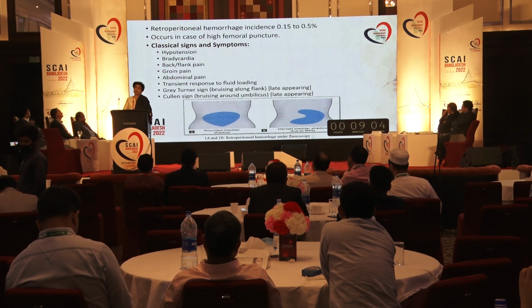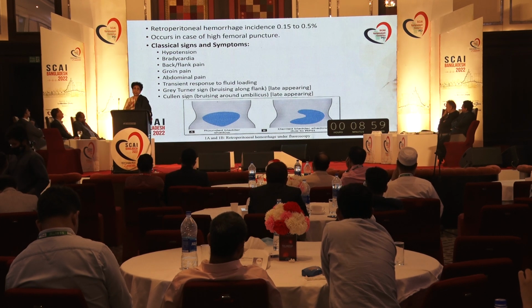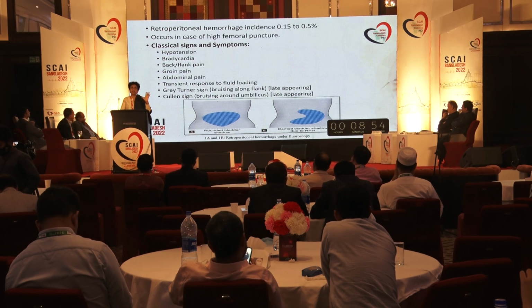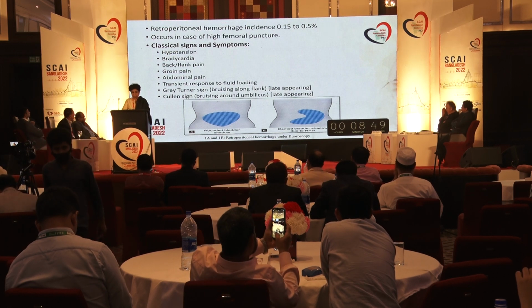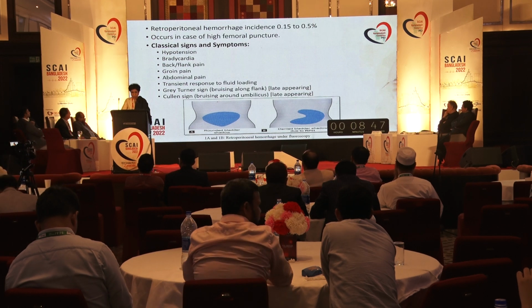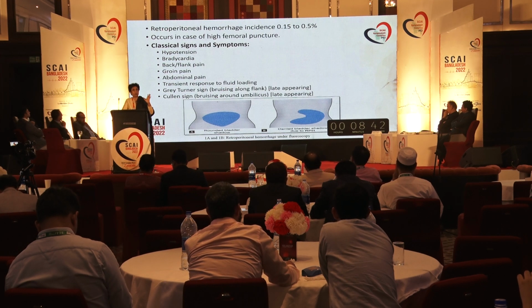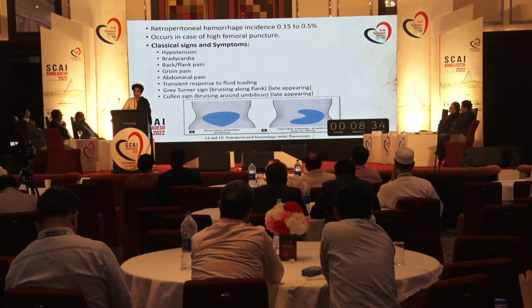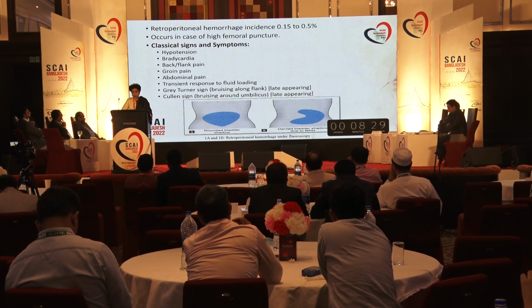Now, if it's a retroperitoneal bleed, which our patient had, one very easy way to detect it immediately is to take the patient to the cath lab and do fluoroscopy. And if there is dye in your urinary bladder, usually the bladder should be round and oval shaped. But if it is indented from one side, it means that there is a retroperitoneal bleed, and the blood is pushing your bladder and making it look eccentric. So that is one sure way of understanding that there is retroperitoneal hemorrhage.